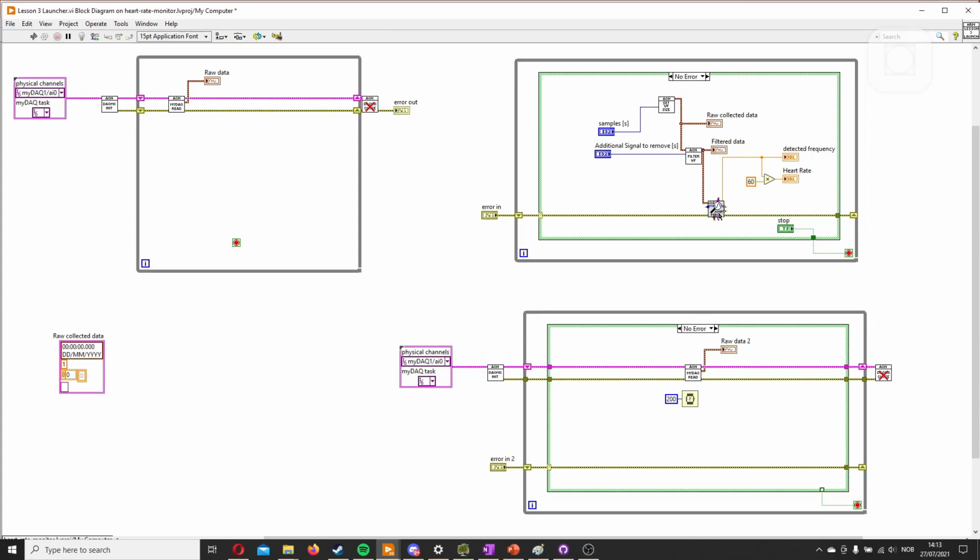If we don't hook up the error wire from this, we'll get an annoying pop-up every time there's an error with a VI, and it will just continue coming up because we continue to run the application, and then we would need to stop it with abort execution. This means that something is bad because when the end user is using your application or you have compiled it, you don't have these same functions. You need to rely on the stop button, or it's stopping by itself, and it will do this now.